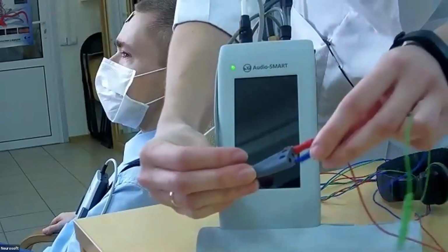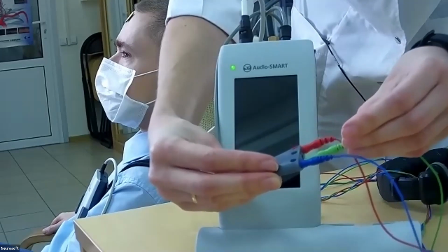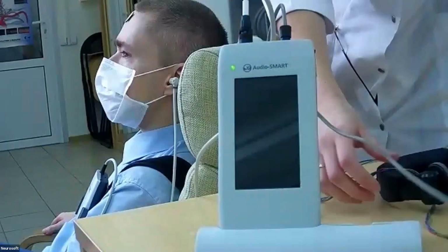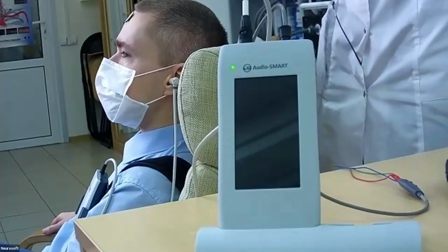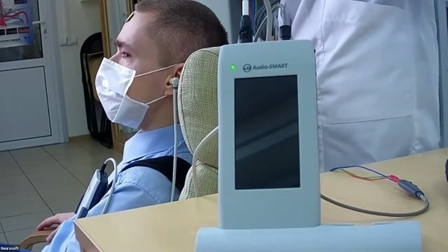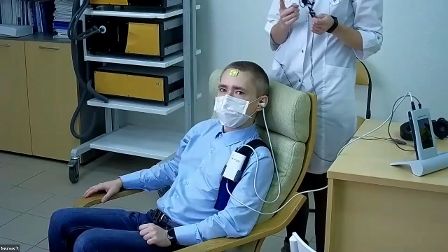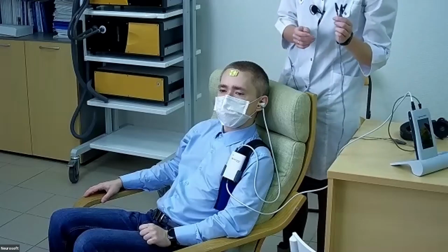Yes, blue and green. We need only 3 cables. Instead of Neuro Audio yesterday, where we used 4, the Audio Smart device registers evoked potential using 1 channel only, the ipsi channel. That's why only 3 cables.